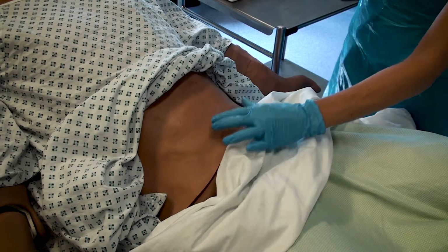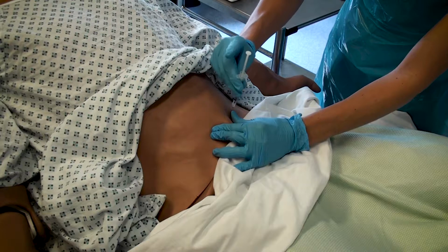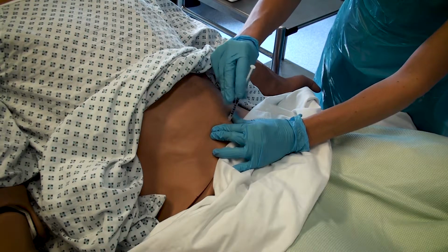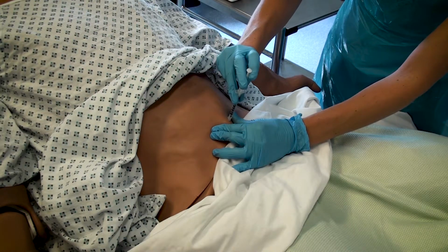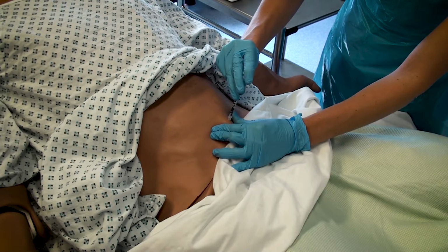Pinch the skin upwards about 2 centimeters of thickness and insert the needle at 90 degrees for a shorter needle. If you are using a slightly larger needle, you may need to go more 45 degrees. Inject the whole drug, withdrawing slightly prior to injecting the drug to ensure that you have not hit a vessel.